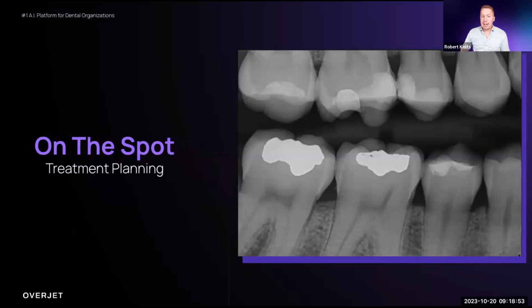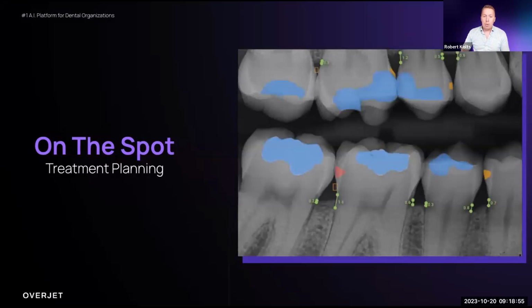And so now I want you to have that experience, and I want to overlay artificial intelligence over the top of it. Now, looking at one image, this may not have just blown your world. This may not have changed drastically what you saw on this one x-ray, but I want you to do that same exercise now. Do you see caries on this radiograph? Do you see failing restorations? Does this patient have bone loss or calculus?